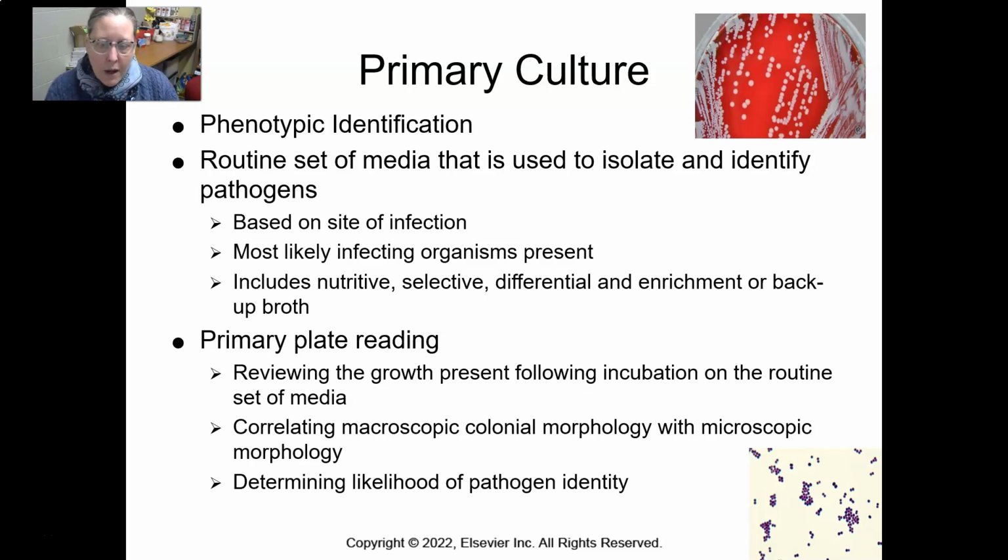Once it's all correlated, you're like, yes, this makes sense, then it helps you to determine the likelihood of the pathogen identity, and it also helps you to know what biochemical identification to set up.